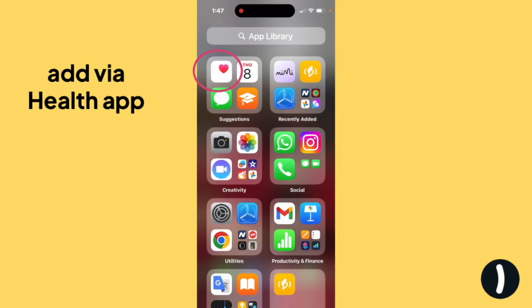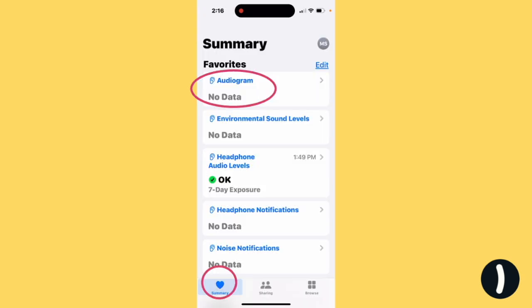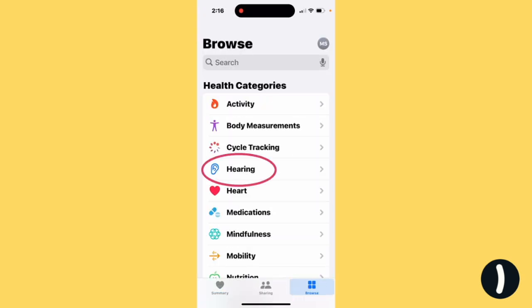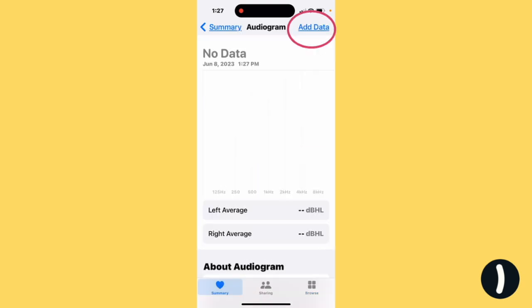You can add your audiogram through the Health app or through Settings. With the Health app, if your audiogram doesn't show up on Summary, go to Browse and then Hearing, and under No Data Available, you'll see Audiogram. Tap there.